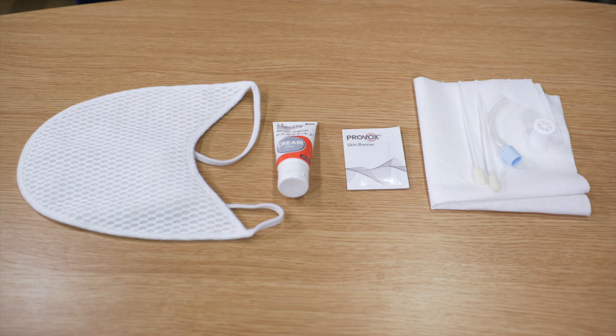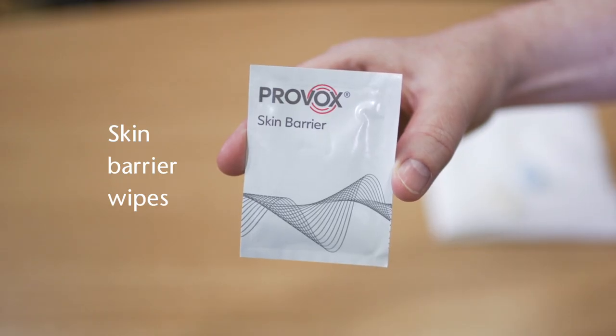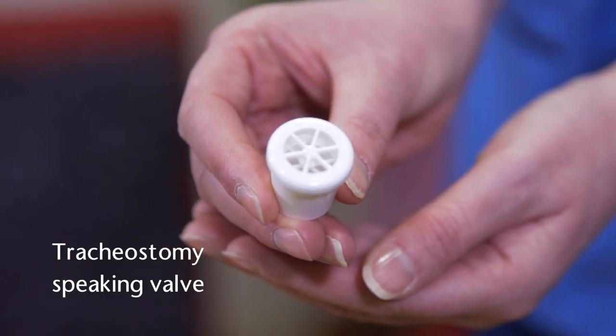So this is what we'll be using today. We have the Buchanan Protector, Barrier Cream, Skin Barrier Wipes, Cleaning Swabs, Tracheostomy Inner Tube, and a tracheostomy speaking valve.